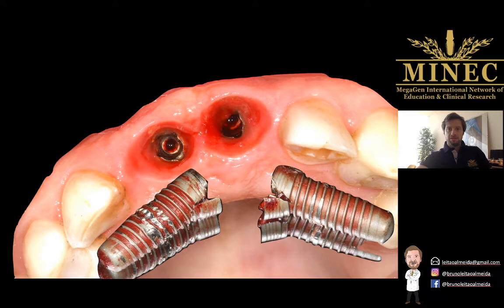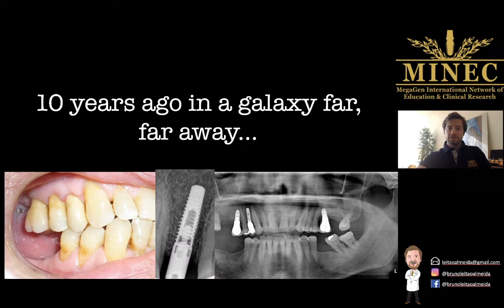She lost faith in dental implants, and the solution in this case was a conventional fixed prosthetic using adjacent teeth as support. So when we lose an implant like this, we can also lose a patient, and this is a true headache, and dealing with it can be quite difficult for all of us. So I'd like to present to you this case.